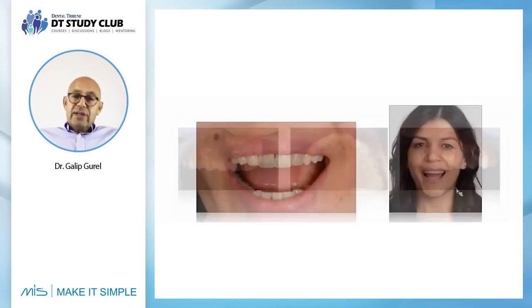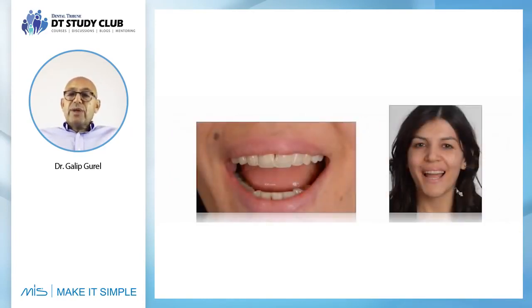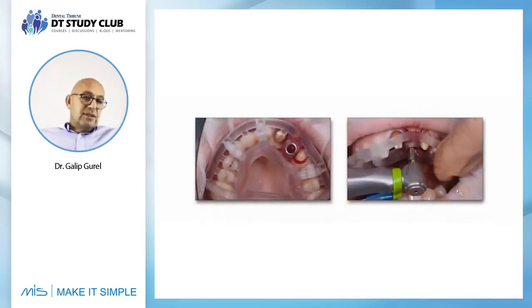And we will be on the left lateral. So what we will be doing is to try to equalize everything and just place an implant into this lateral tooth number 22 or whatever, left lateral.